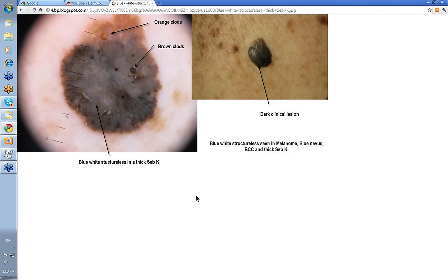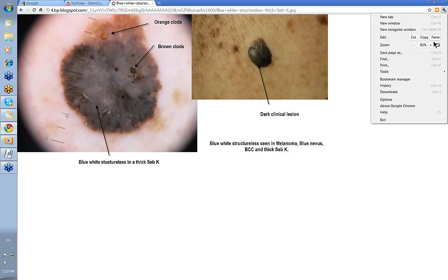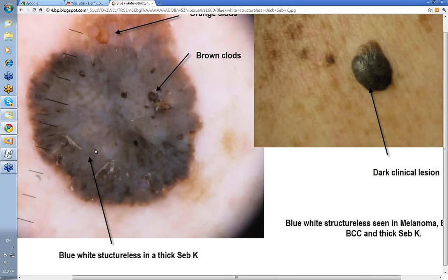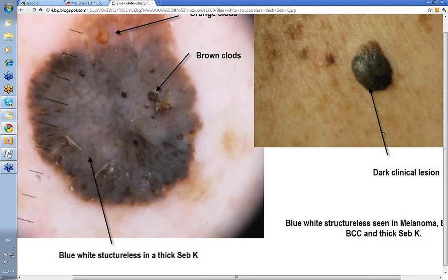Here's another case where there are elements of blue to show you. If you look at this lesion, you'll see these blue-white structures — that's a bluish change. This is due to thick orthokeratosis in a seborrheic keratosis. You've got a lot of epidermal hyperplasia and it gives that sort of picture. So you can get blue-white Structureless in very thick dark seborrheic keratosis — you can see clinically how dark this lesion was.